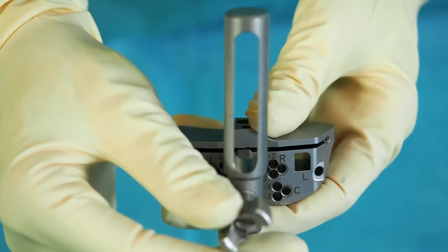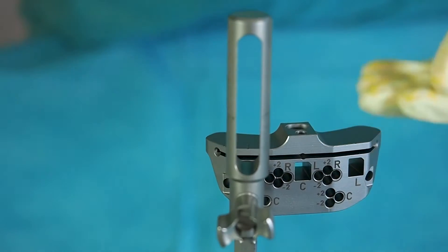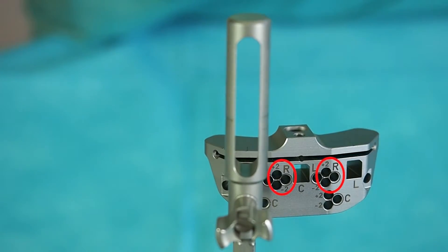In case of a less invasive approach for the right knee, engage the holding rod in the hole marked with R. For fixation, use the highlighted pinholes.